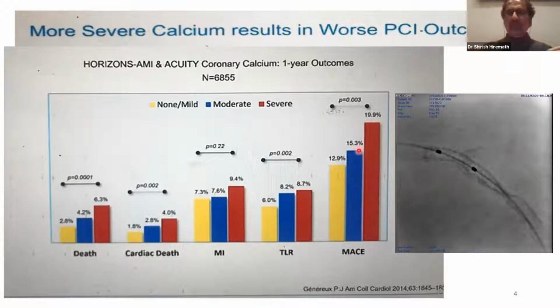So it makes you and I understand that the moment we talk of calcified coronaries, or for that matter, calcified aorta, calcified iliacs, calcified carotids, we are going to be dealing with a tougher subset, and probably new techniques would be required. Now, this is what typically happens if you don't prepare the bed before you take a stent.